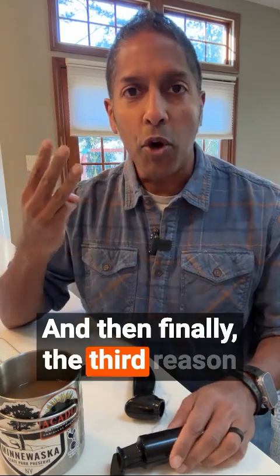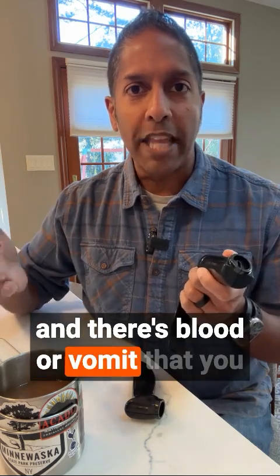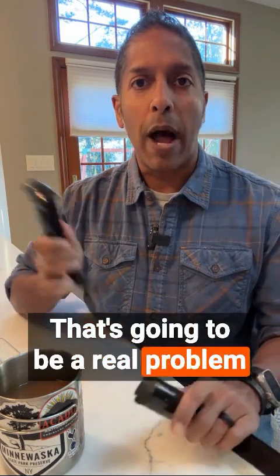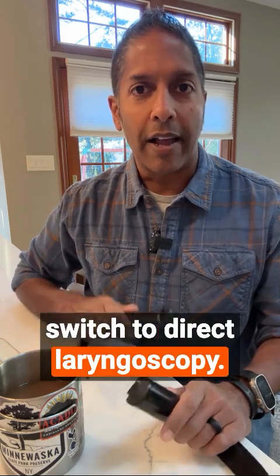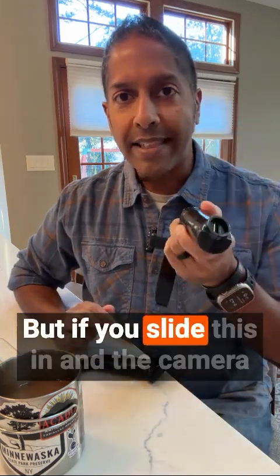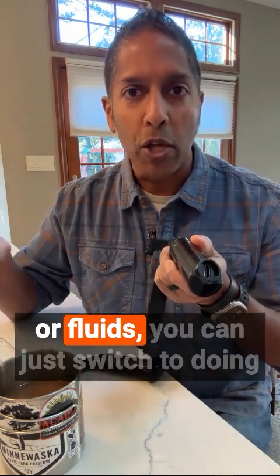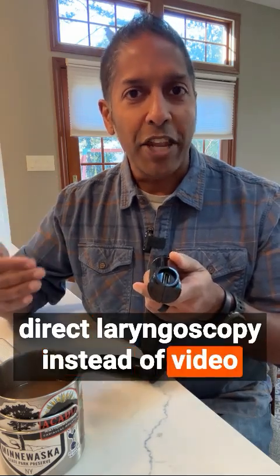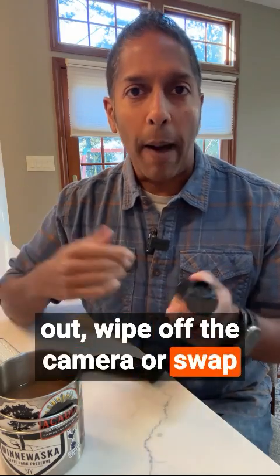And then finally, the third reason is that if you go into the airway and there's blood or vomit that you didn't expect, it can cloud that camera. That's going to be a real problem with your hyperangulated blade, where you can't easily switch to direct laryngoscopy. But if you slide this in and the camera gets clouded with some kind of debris or fluids, you can just switch to doing direct laryngoscopy instead of video laryngoscopy. You don't have to take the device out, wipe off the camera, or swap out the handles.